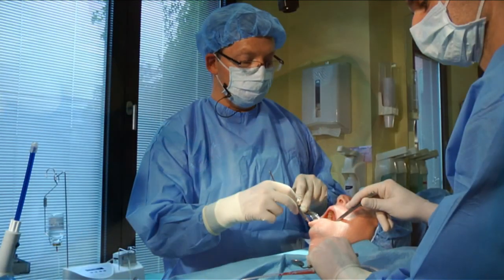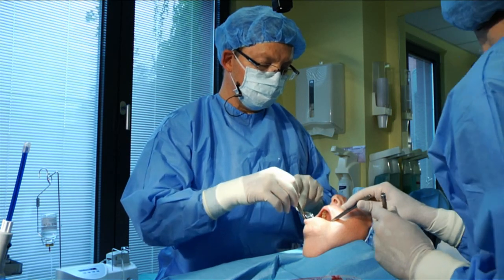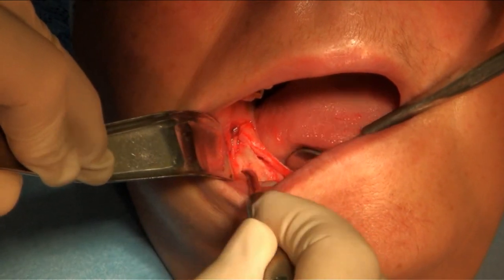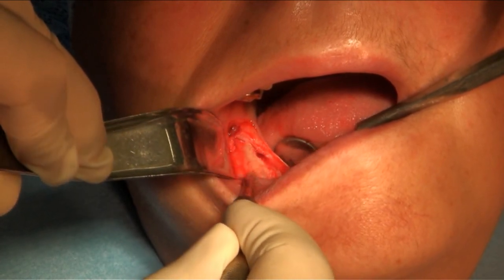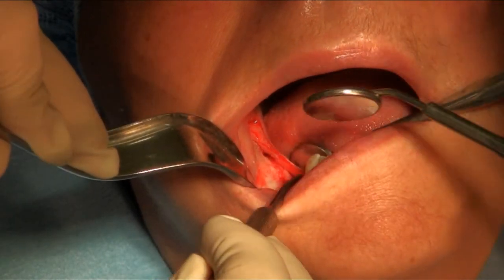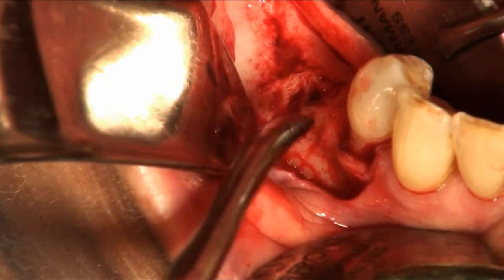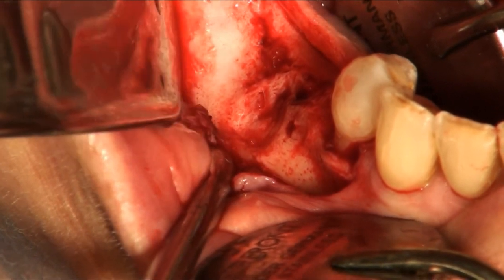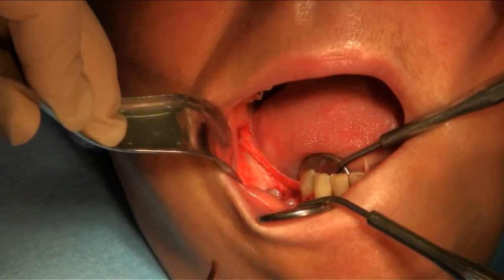So here we have the defect extension in the area of former molars in this region, and we will obtain the autogenous bone block in the posterior region somewhere along this line, transplanting this bone graft to the more anterior area in this region behind the first bicuspid on this side. And we will use piezo surgery for releasing this bone block in this area.